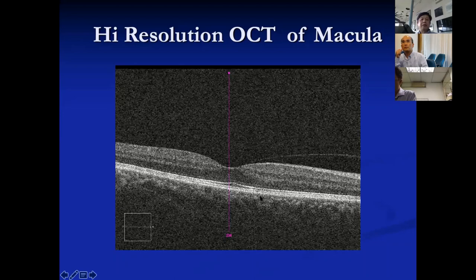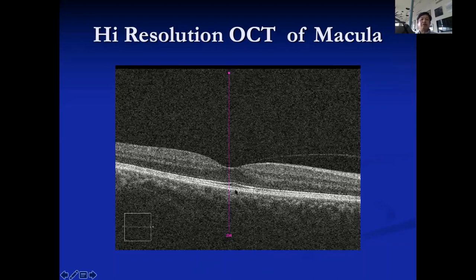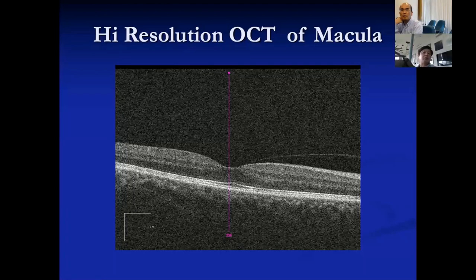So in full thickness, this is the neurosensory retinal layer, then the RPE, then Bruch's membrane and the sclera. The spongy appearance underneath is due to the abundant vasculature of the choriocapillaries. If any pathology comes from under the retina, you can see a breakthrough from there. I recommend using black and white to interpret OCT rather than false color, as it gives superior resolution.